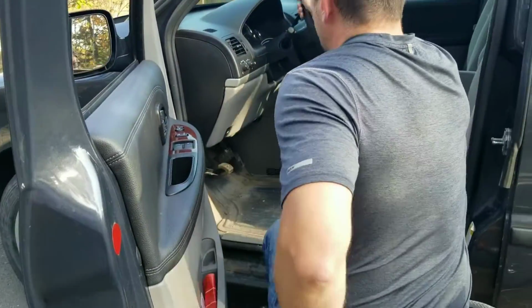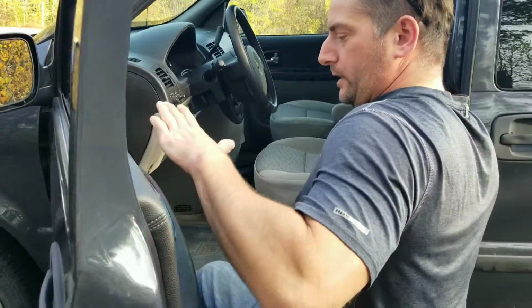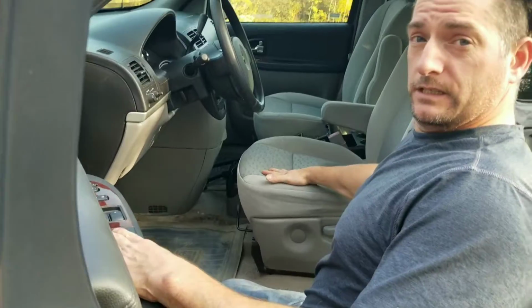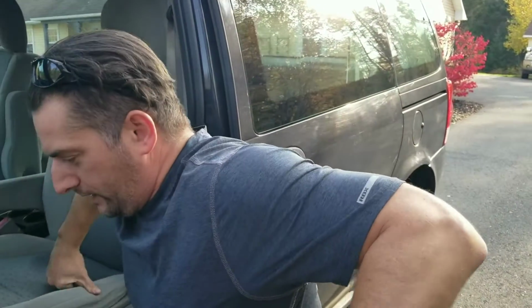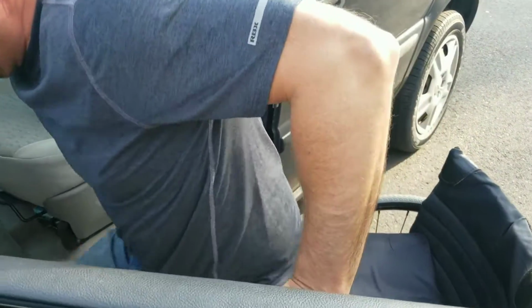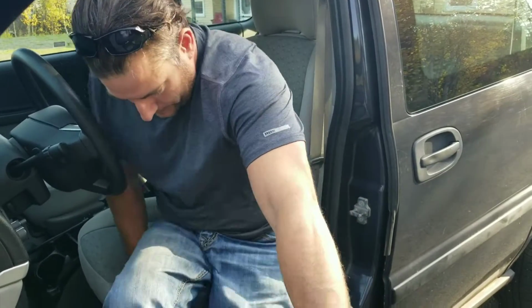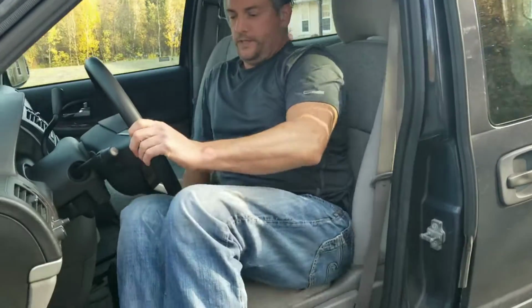Some people may grab the steering wheel and transfer over. I always put my hand here and my hand on the base where I wanted to sit. So I would just transfer that way. Now I'm not going to use my legs, so this is all weight, arms up and over. Transfer that way, and sit on your hand. Okay, and then tuck your feet in.